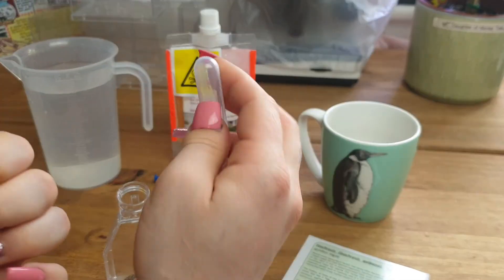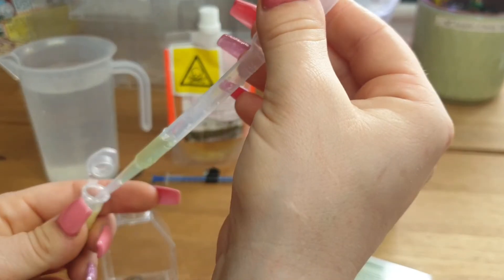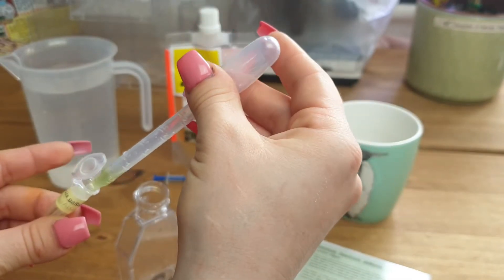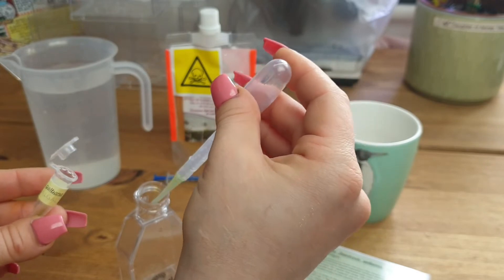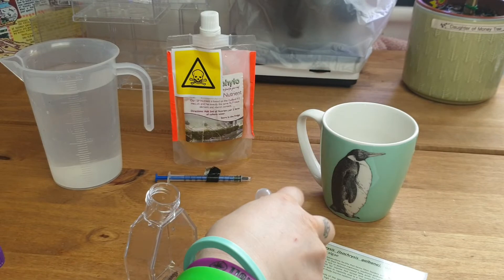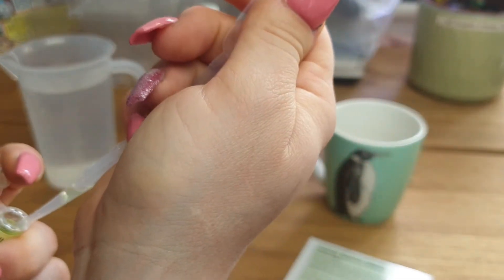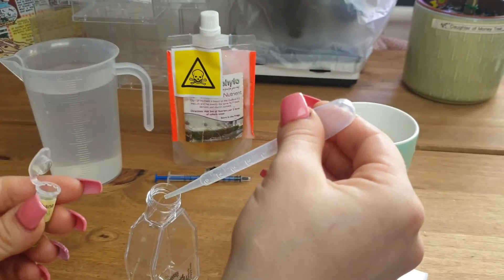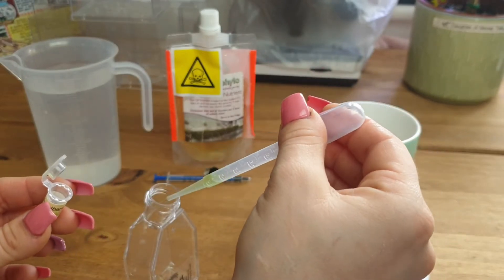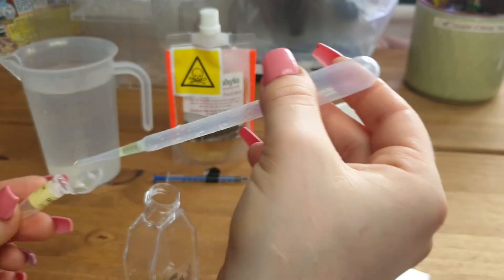The best way of doing this is with a pipette. I'll just pop that all straight in. There we go — that's one. We'll get the second one. And that's all out of there.